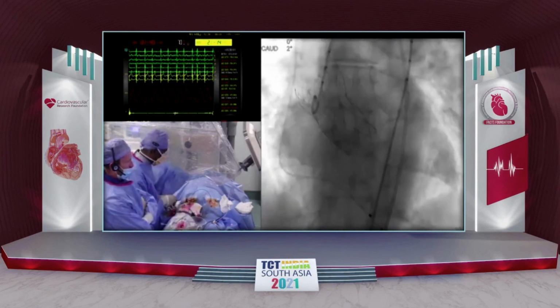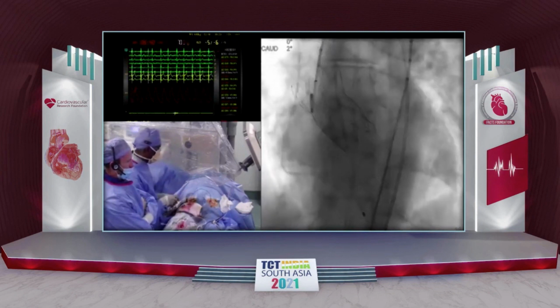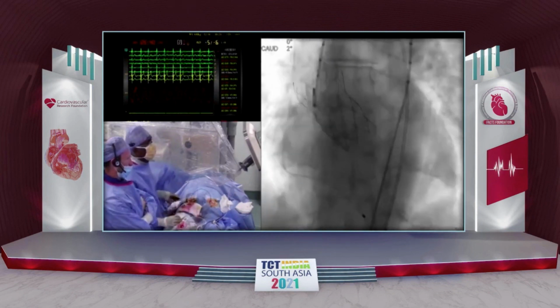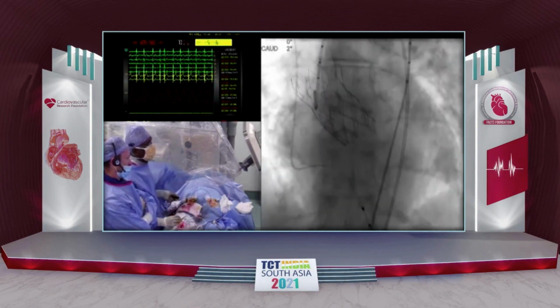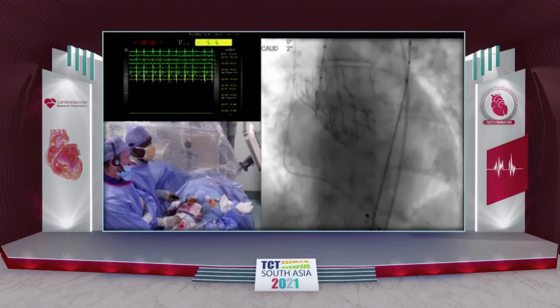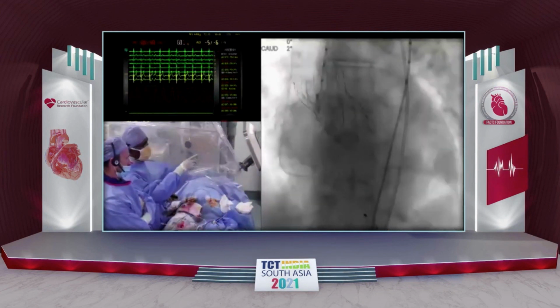Are there any questions? Dr. Ganesh, sometimes in horizontal aorta, if the valve is quite well positioned towards one side and looks deeper or higher than the other side, for the sake of beginners, what would you advise your strategy should be, in spite of trying all that, when it is still fitting like that? So my strategy would be to use this valve.